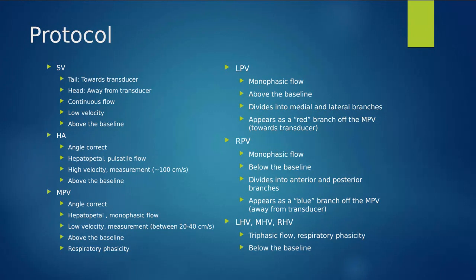And that would be our bidirectional flow, or the hepatopedal and hepatofugal flow. Remember, hepatopedal into liver, hepatofugal out of liver. It's going to appear low velocity with a continuous waveform. We said it's going to appear bidirectional. We are also going to see very commonly a recanalized umbilical vein. So that left portal vein is going to open back up.